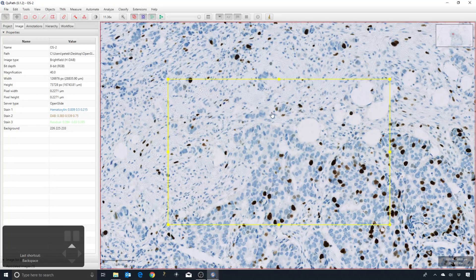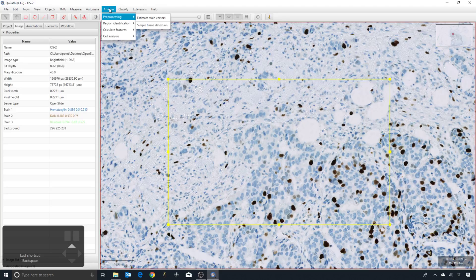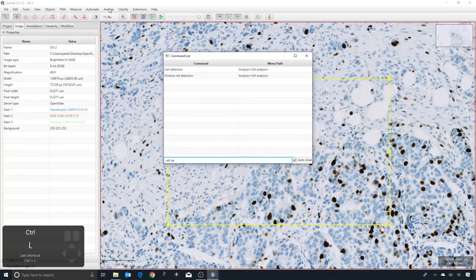I've selected a region here, and I can go to Analyze > Cell Analysis to find the command there. I don't really recommend going to the menus though — I recommend instead memorizing the shortcut Ctrl+L, which will bring up a command list. In that list, I can start to type 'cell detection' and that will bring up any commands that have that in the name, which is a much easier way of finding the commands you want.